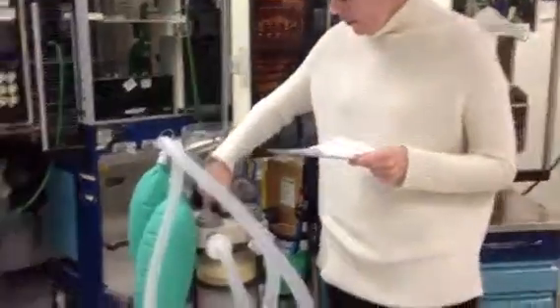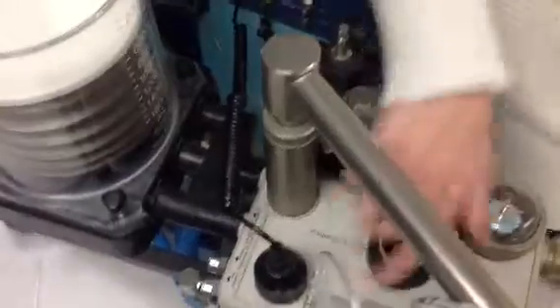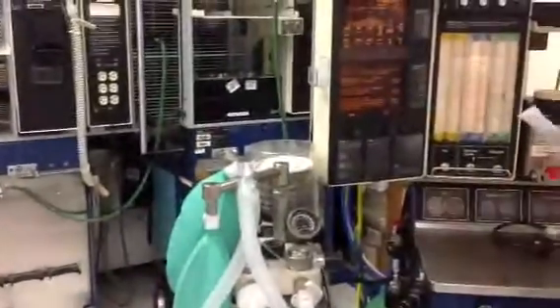Switch to bag mode. Oh, I forgot to do that. Sorry guys. Switch to bag mode. And bag your patient through here. Make sure that the lungs inflate and deflate. This is what you should do. Stop right now. Stop the film.